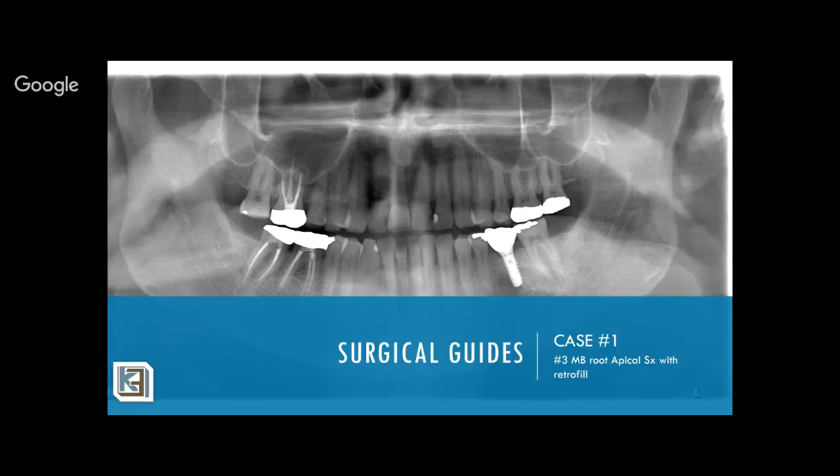Okay, and how long could those burs be used for, or how often could they be used? They are actually very, very good burs and very stiff. I would say you can probably use them 10 times at least before you throw them away. And again, like I said, they come in a set of 6. You only need the first 3, so you can purchase the first 3 or you can purchase all 6.